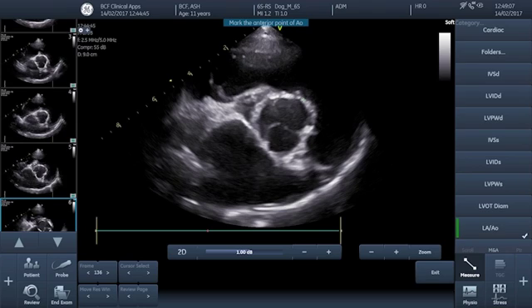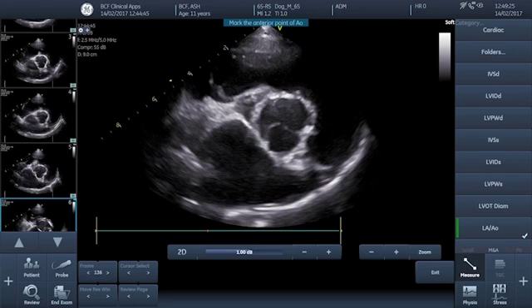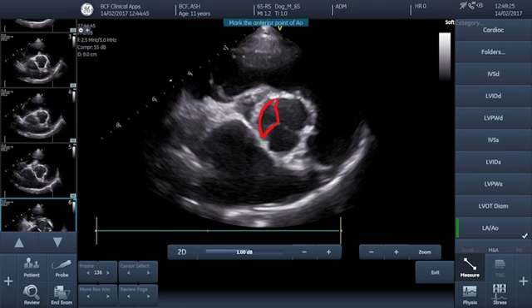The first step in the Swedish method is to place the first cursor point at the start of the line we're going to draw across the diameter of the aortic root. Using the Swedish method the first cursor is placed at the right aortic sinus, and we then extend a line across the diameter of the aortic root going through the point where the aortic valve leaflets meet — the centre of the Mercedes-Benz sign. The line should extend along the boundary between the left coronary cusp and the non-coronary cusp, which is the lower left arm of the Mercedes-Benz sign as you look at the image. The obvious question is precisely where to place the cursor given that the aortic wall has a finite thickness.